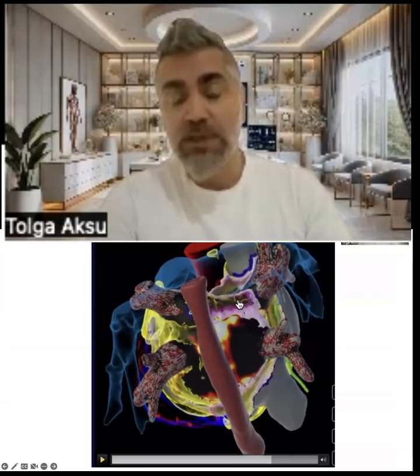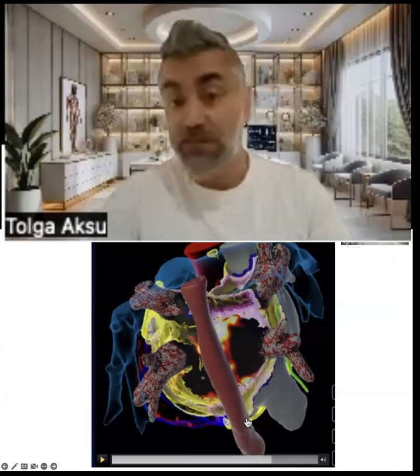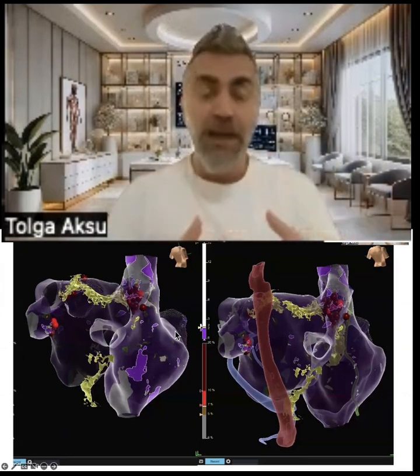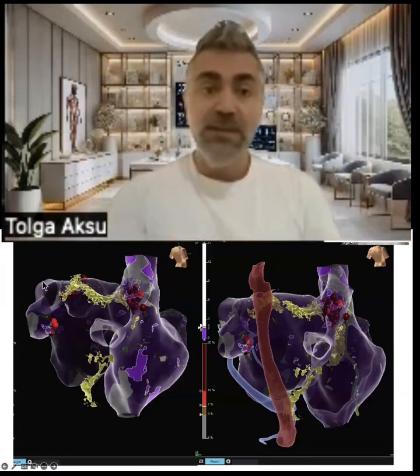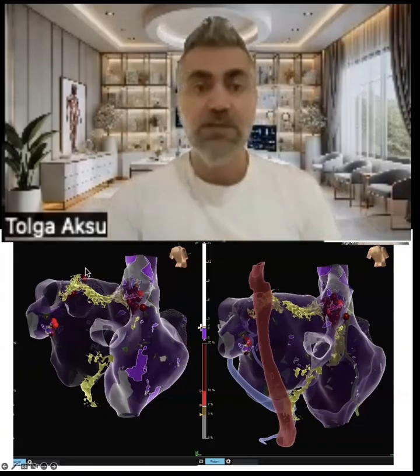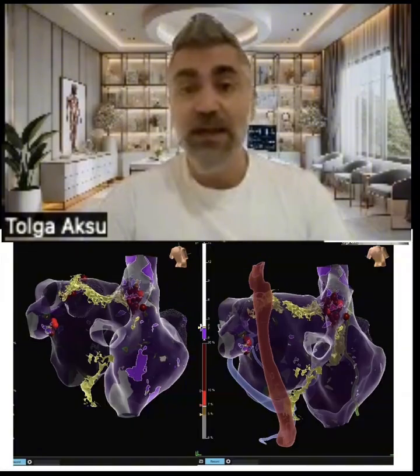Look at the location of right superior GP, left superior GP, right inferior GP, and posterior medial left GP, very close to esophagus. And then we can combine 3D CT, epicardial fat pad, and 3D map, fractionation score, and peak frequency map. And then we can easily ablate this area.